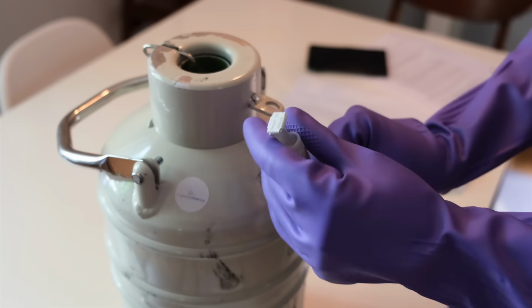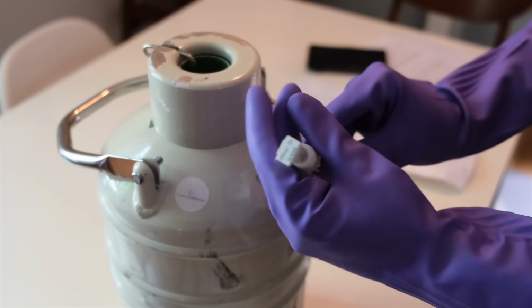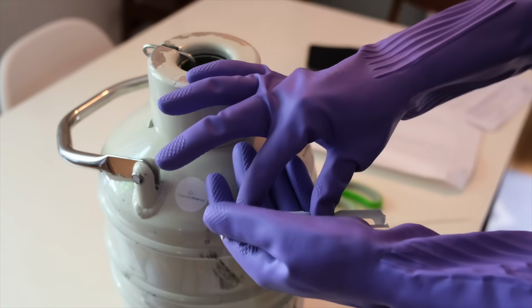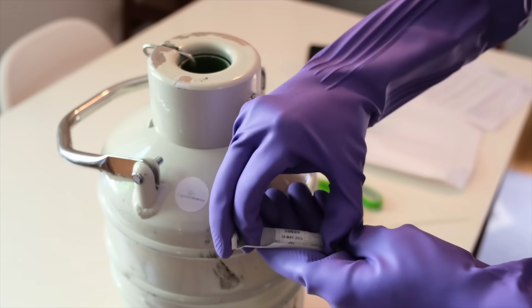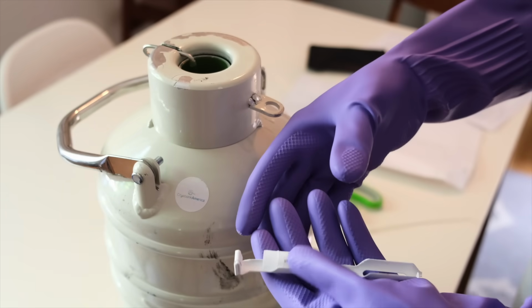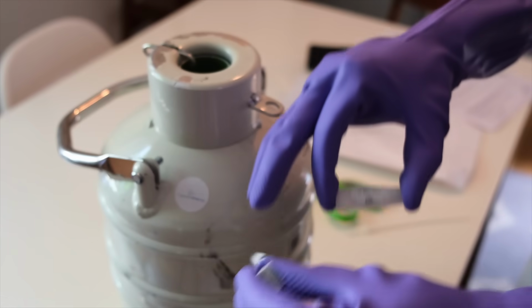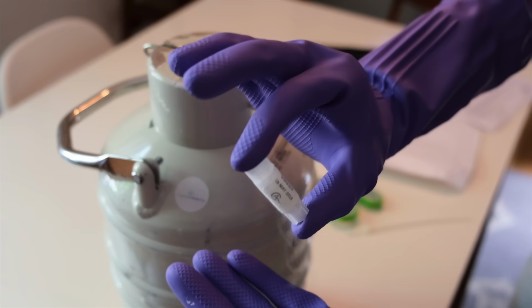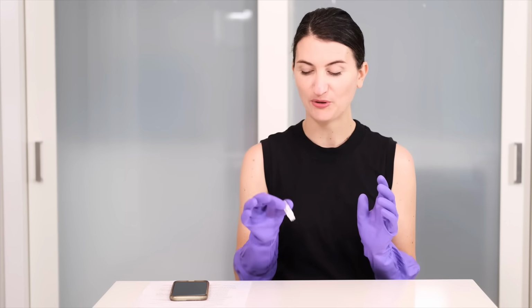At this point, I recommend double checking the information labeled on the vial and on the top with your paperwork. And when all looks good, you can pop it out. So to do that, just grab your fingers, top and bottom, and just pop it out. If you need to, you can even pop it back in like that. For now, we're gonna pop it out as we're gonna prepare to thaw our vial. So congratulations, you got your vial out of the cryo tank.